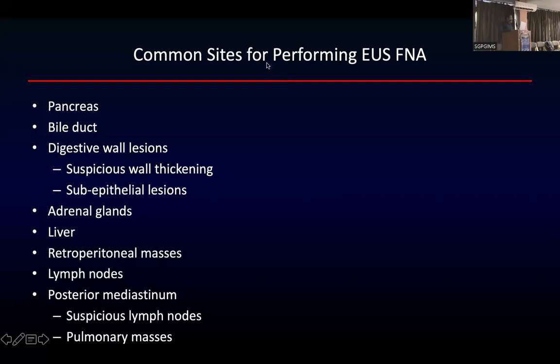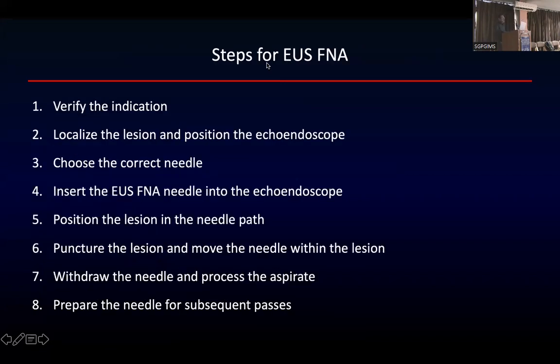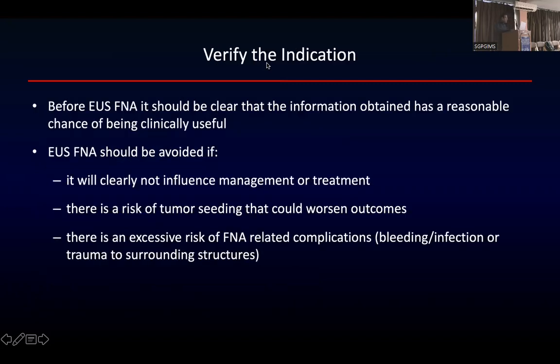Okay, so I'll just skip through the theoretical part. I'll just come to the practical aspects of doing the FNA. I'm not going into the indications and the contraindications. Contraindications obviously are the same as for any endoscopic procedure. So technical aspects: verify the indication, localize the lesion and position the endoscope, choose the correct needle, insert the EUS FNA needle into the endoscope, position the lesion in the needle path, puncture the lesion and move the needle within the lesion, withdraw the needle and process the aspirate, prepare the needle for subsequent passes. So these are the steps that you need to know about EUS FNA. We'll not go into any theory, we'll just talk about these technical aspects.